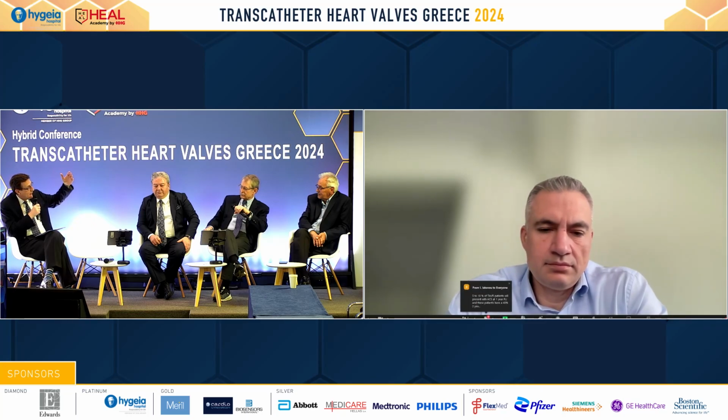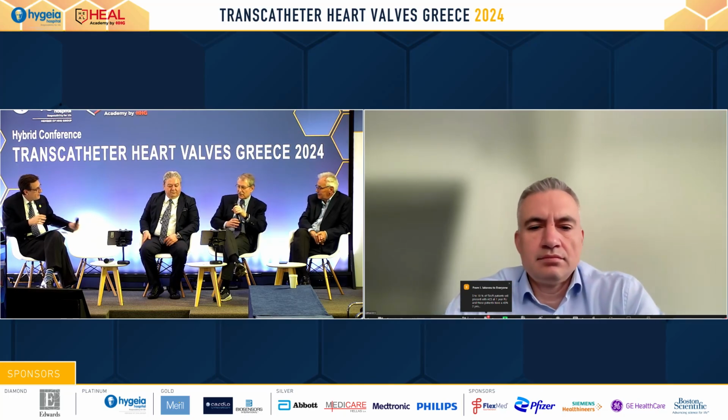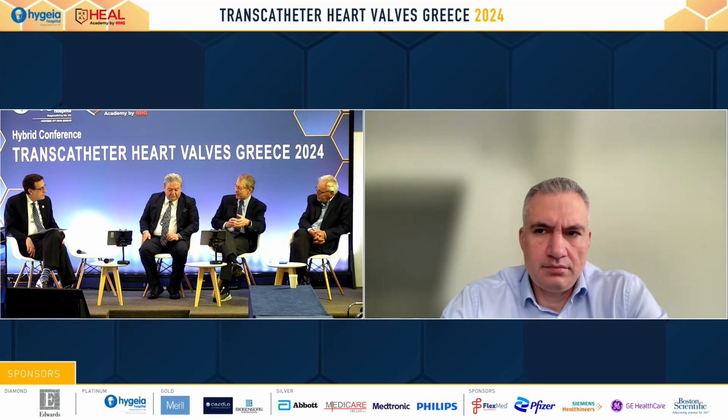You know, I'm not sure we're anywhere, quite frankly. It's just becoming a reality with all the waves of these TAVI valves that some of them we'll treat with valve-in-valve, but some maybe not. Does it vary according to what kind of valve you had before, let's say a CoreValve or a balloon expandable, a taller or a shorter valve? Yeah, well, clearly the taller valves, all the self-expanding taller valves, are going to have a harder time having a valve-in-valve. We usually put a balloon expandable inside a self-expanding, and when a balloon expandable fails, we put a self-expanding inside a balloon expandable.